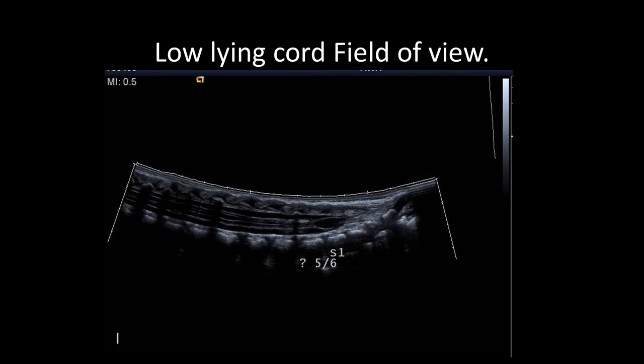The third reason for looking at the middle cerebral artery would be looking for raised intracranial pressure, and I think if there is no clinical indication or clinical signs for that, you may choose not to look for middle cerebral artery Doppler in an infant. If the infant is just coming to you because they've got a big head, but it's not really crossing centiles and there's no other clinical signs with it, I wouldn't have thought that it was an essential thing to do. I'm not quite sure what information it would help you with.